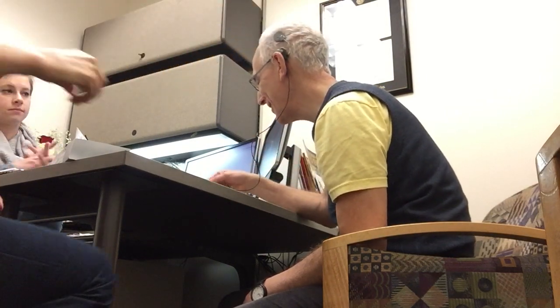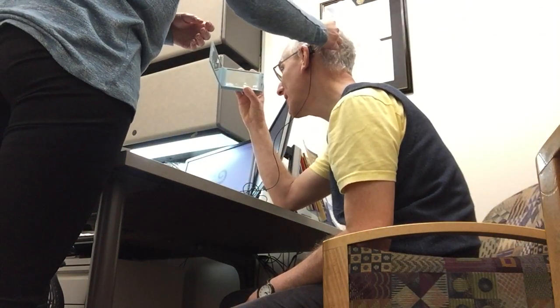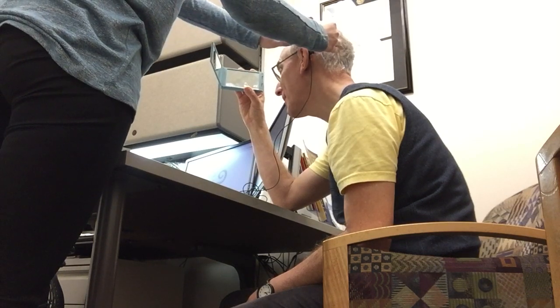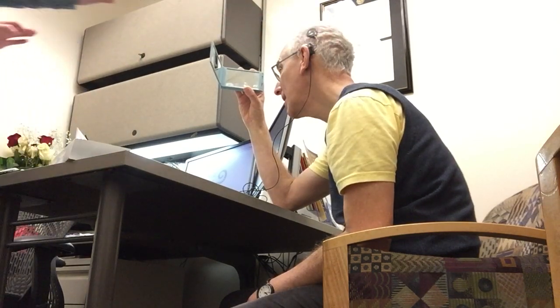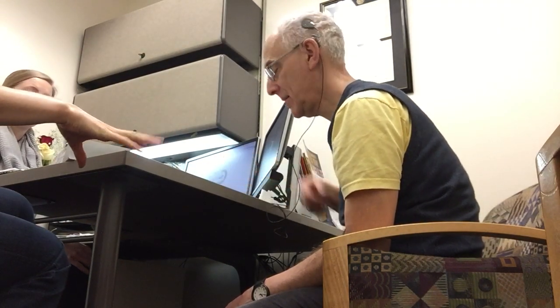Do you want to feel it? I felt it when you first put it on, and then it went away. I got used to it. I'm going to test the magnet strength there. Sometimes, after surgery, there can be a little swelling, and that generally goes away on its own. So we will continue to monitor that magnet strength very closely. It should never cause pain, discomfort, redness, or anything like that. I don't imagine having that occur for you at all.